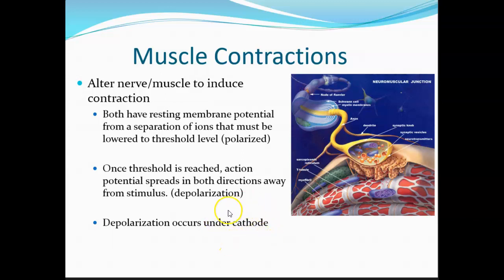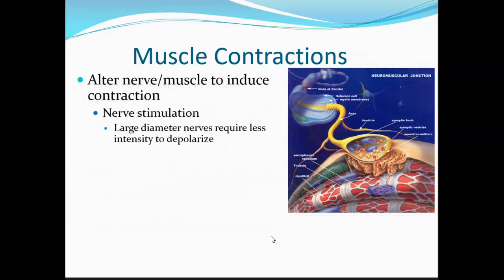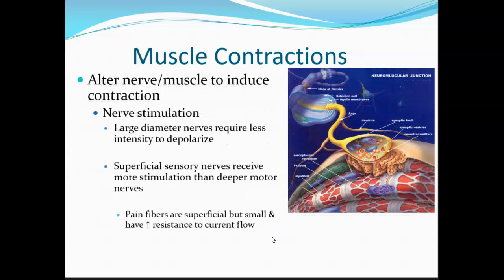So as you set your treatments up, you want to look at, all right, where's my negative pole? If I'm trying to get a contraction, let's put that on the muscle or where I want it to get contracted. Your book does talk about this in chapter 12. It gives you a lot more specifics than I'm giving you, and actually gives you the actual pulses per second and all. But here's the deal.